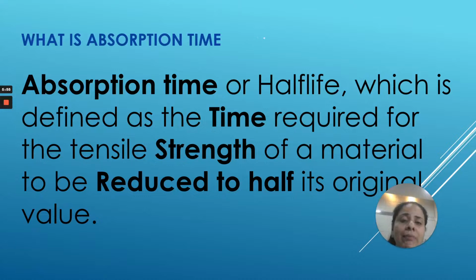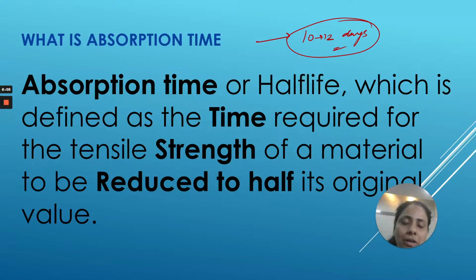Means if I am putting a suture material into the oral cavity and my healing time is around 10 to 12 days, suppose, I don't want any suture whose half life is just 2 to 3 days, because within 2 to 3 days it will lose its tensile strength and it will be of no use to me.